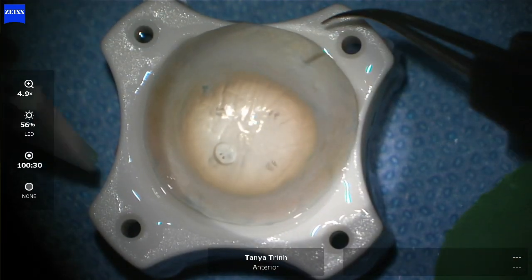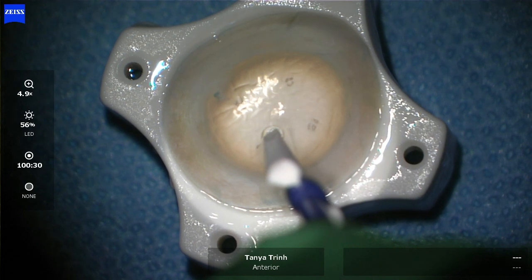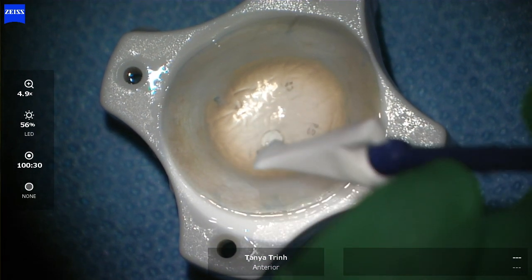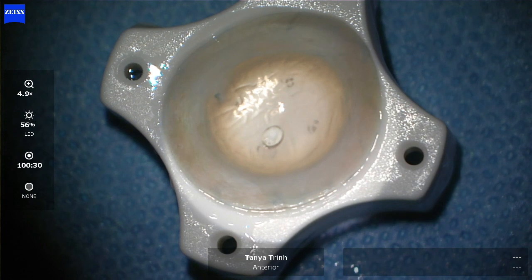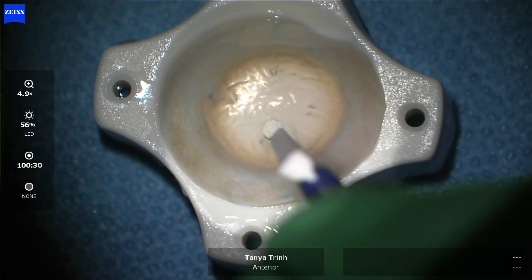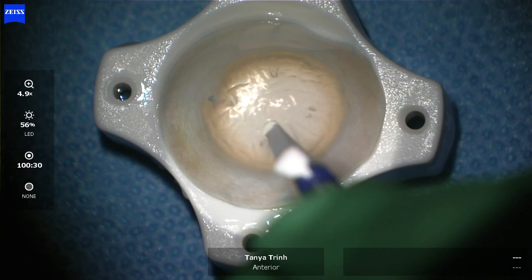This step is incredibly important, although seemingly minor. The reason is that I don't want any additional fluid seeping into this central aperture, which I'm trying to dry at this step. You will find that you use a number of dry spears or Weckcels, because in their dry form they fit neatly inside that aperture. I'm focusing really on the edges of the base of that aperture, as this is the point where fluid is most likely to seep in. You will take a little bit of time with this step and use a few Weckcels to make sure it's completely dry.